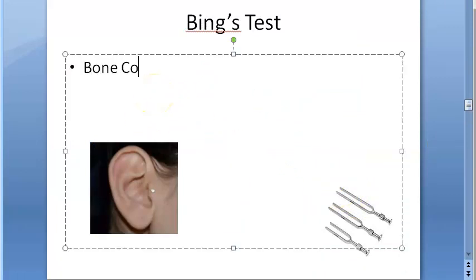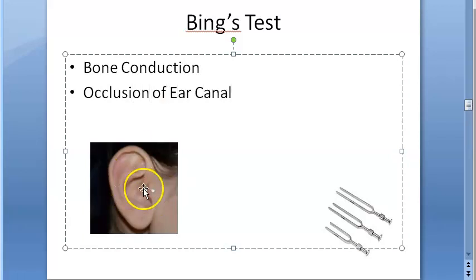Bing's test checks bone conduction and examines the effectiveness of occlusion of the ear canal — what happens when you occlude the ear canal. Inside you have the ear canal, and you will occlude it with the tragus itself. Here you have the tragus, and by pressing the tragus you'll occlude the ear canal.